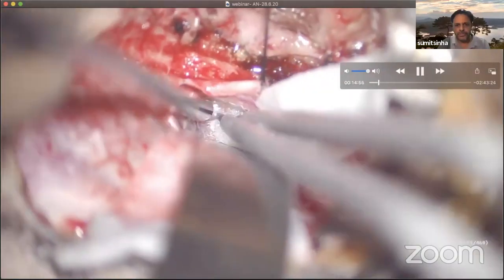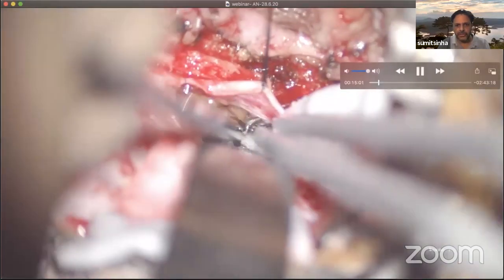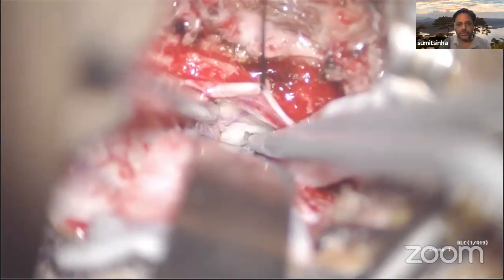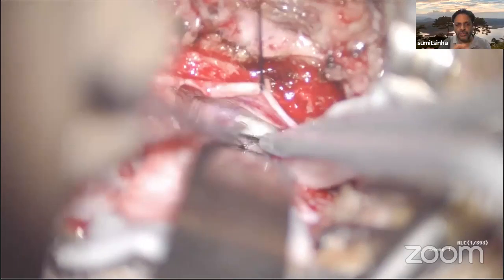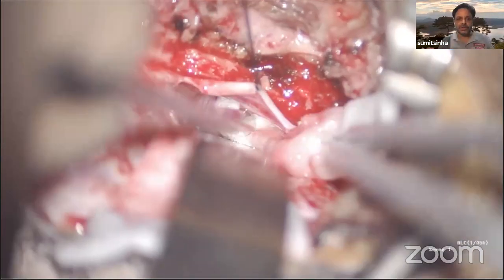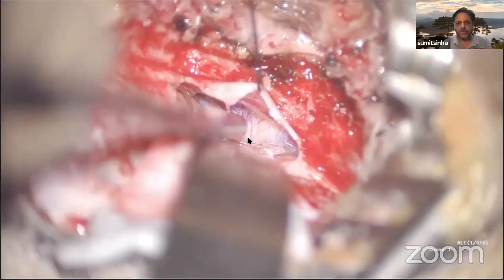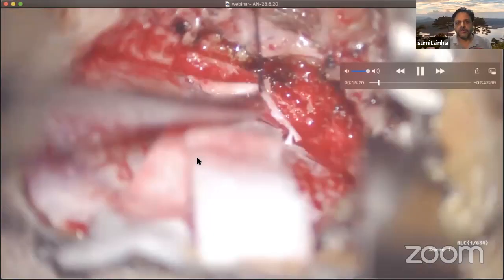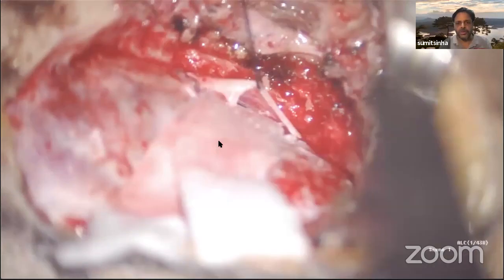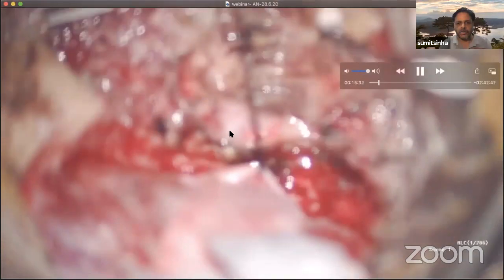Some more CSF. This is the most important step, and you should spend a good 10-15 minutes on it during the surgical procedure, because this step determines your success of surgery. So be very generous, very lax in doing this step in any keyhole surgery. Release the CSF, release some more, till you feel that, now you see, the whole of the cerebellum becomes so manageable, so lax, so smooth. And this is a wonderful thing to see for any keyhole surgeon.